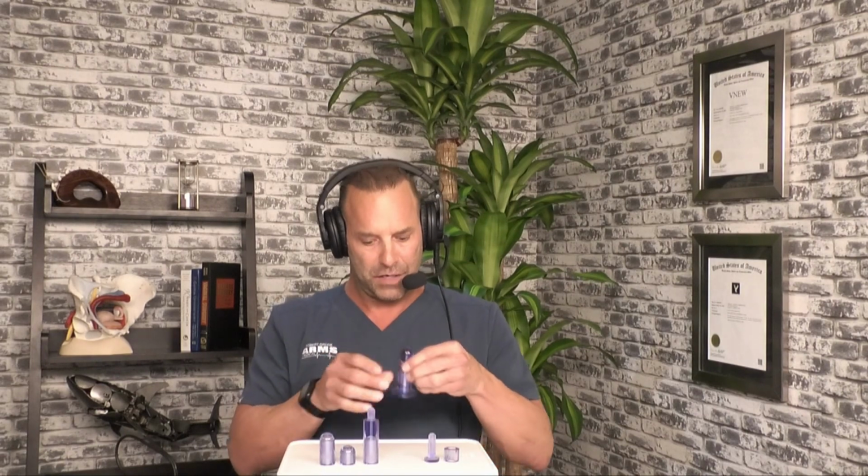And then the goal is that you should be able to sit down on a level type of chair. Might be a dining room chair, might be a chair in your bathroom, but you want it to have some firmness to it. And if it's too firm, you can always place a towel or a cushion on it, but not too thick, because you want this upward pressure, and you want to be able to feel it at the top of the apex of your vagina. And so you don't want it to be painful, but you certainly want to have just some slight pressure.